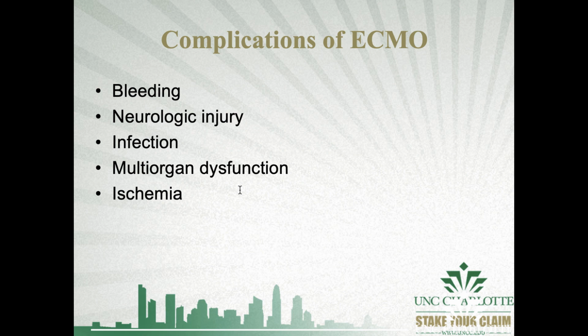There are many complications associated with ECMO. You guys did a discussion forum, and I wanted you to explore these ideas because it's not a fix-all. It really isn't. And sometimes we jump to this way too soon. I feel like at Duke where I worked, it was a big ECMO center, but we really only used it when we had to. But again, sometimes we probably should have gone to it sooner. I could think of an asthmatic patient that I really wish we put on ECMO sooner. She was okay, but still, it could have ended differently.